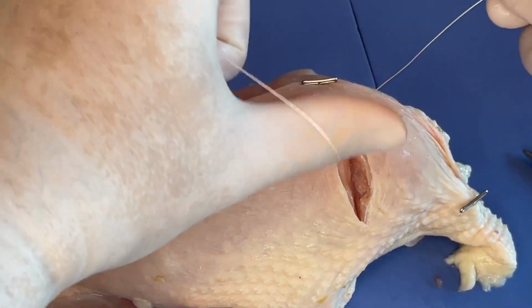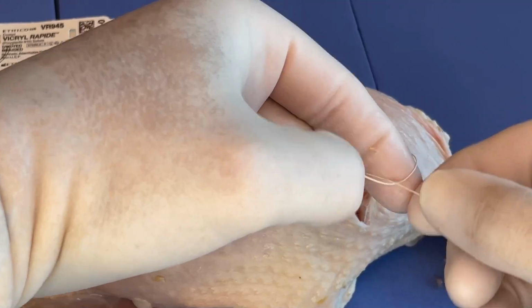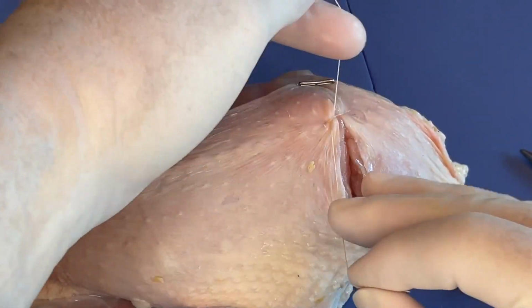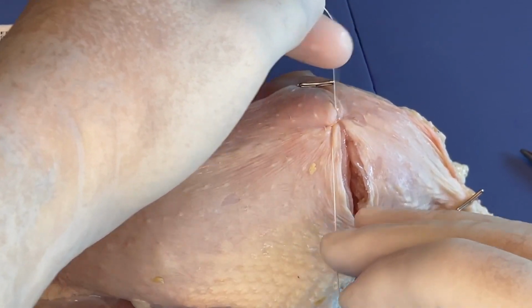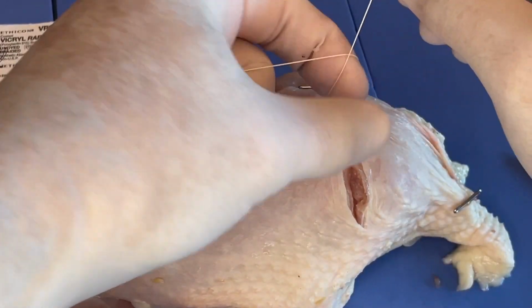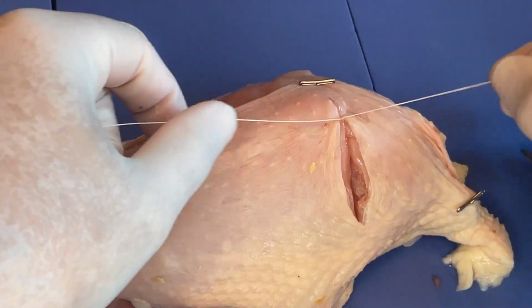So again, I go over thumb first, create our loop there, swing through with the finger, bring that shortened end through, and then again, I don't really cross hands, but I do kind of go opposite directions, or you can just kind of pull straight up and down like that. You can see how that draws the tissue together, but it does relax a little bit, so we want to keep a little bit of tension up as we come up over the finger for that second part, and then as we come down, that tightens up nicely.